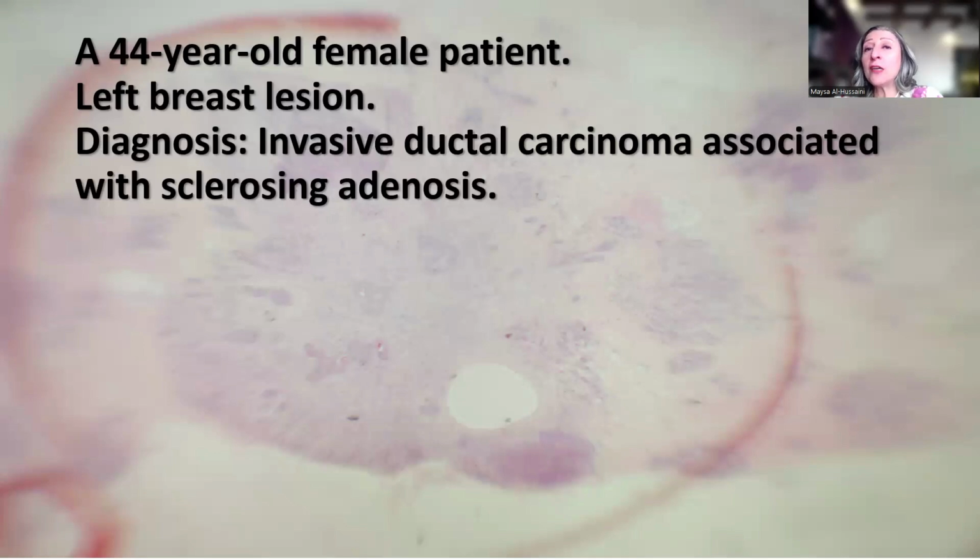And remember that HER2/neu nowadays, even the 1+, has to be mentioned meticulously, specifically because of the availability of targeted or conjugated treatment for the low expressors. And remember that Ki-67 can be helpful to separate luminal A, the good players, from luminal B, the more aggressive type of invasive breast carcinoma.